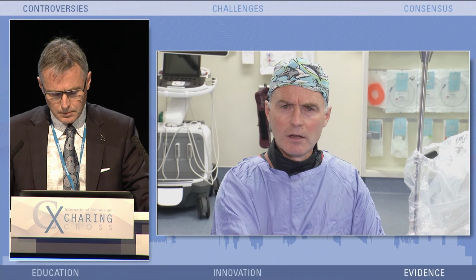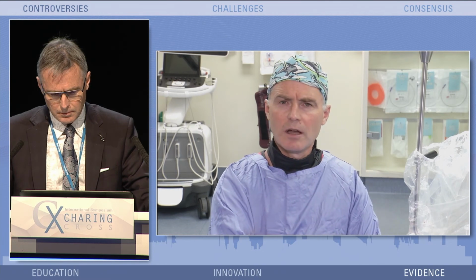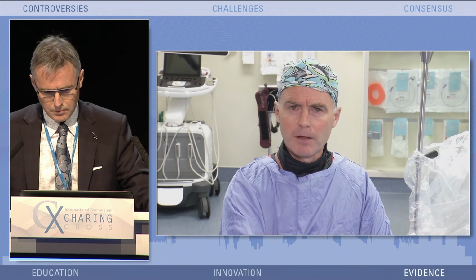But on the left side, we obviously had very nice experience with the balloon and the S4 device to treat calcified tibial artery disease with a very nice result. Thanks very much.